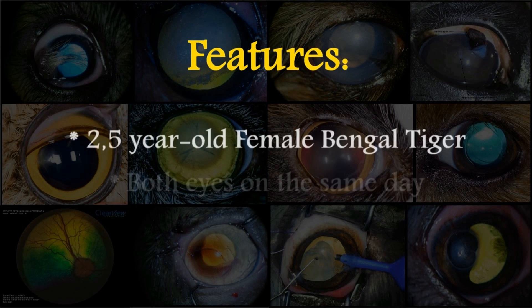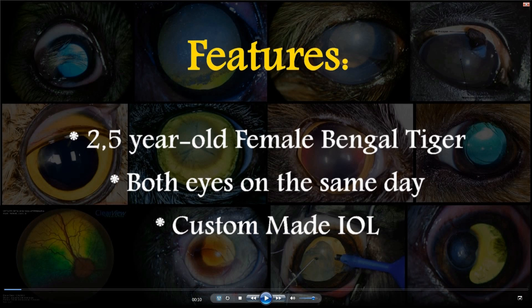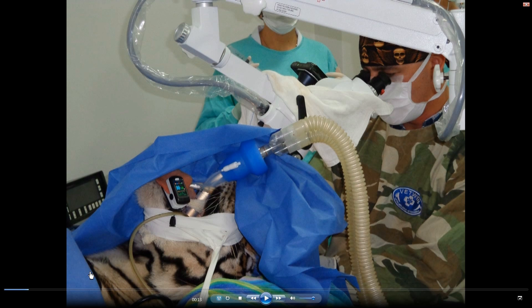Main features of the procedure: the patient was a two-and-a-half-year-old female Bengal tiger, both eyes were done on the same day, and a custom-made IOL was implanted. This is what the positioning looks like — dorsal recumbency. This is our endotracheal tube, utilized for gas induction with isoflurane, the phaco unit, and this is our surgical microscope.